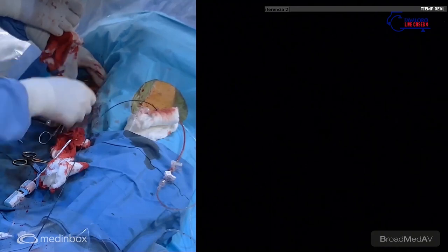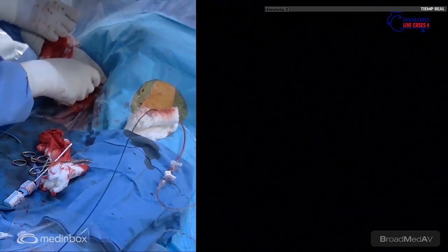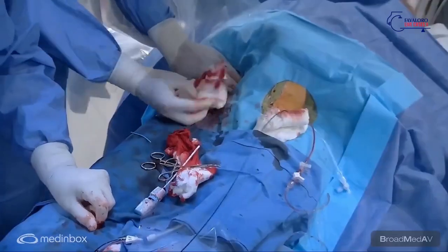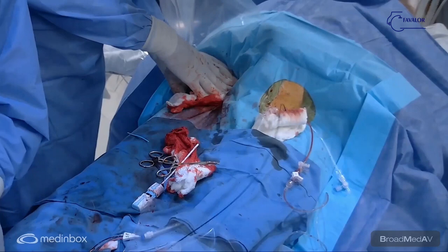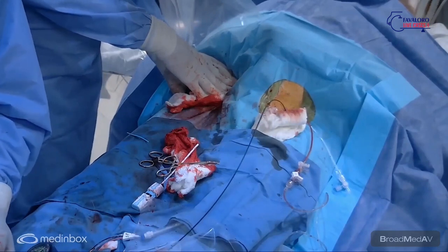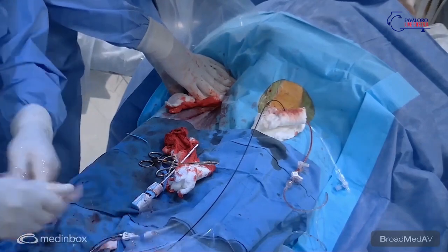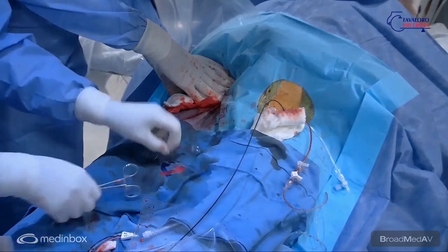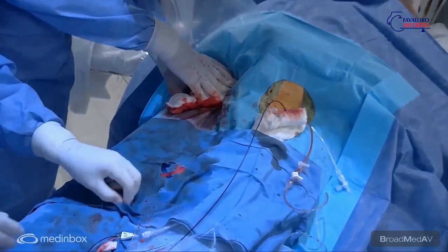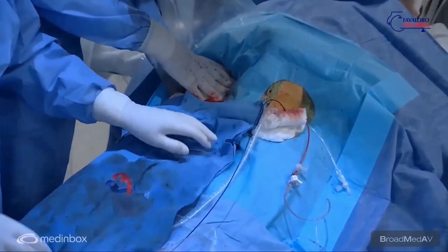And if we don't have bleeding, I think we have to compress and it's going to be okay. We'll see the EKG, how it is in the next few hours. Many times, the left bundle block that we have now reverses with time, but we will see. So far, it is a sinus rhythm. The PR is short. The only change is a left bundle block.